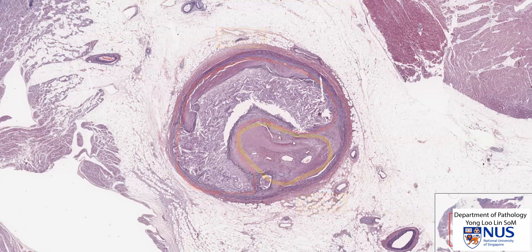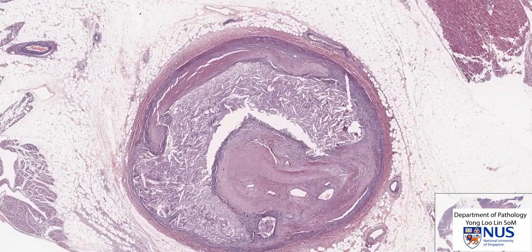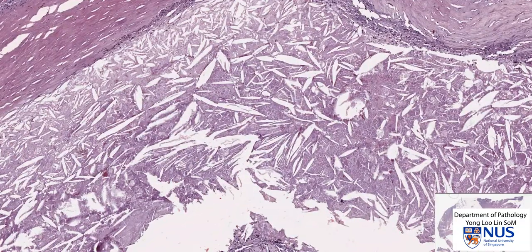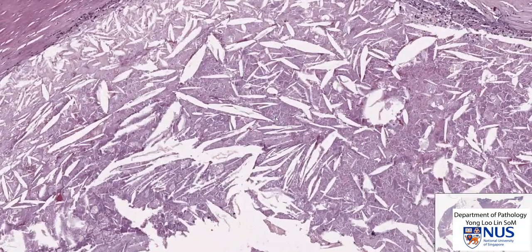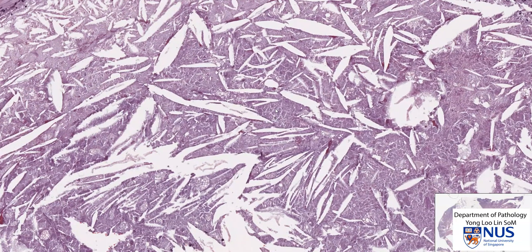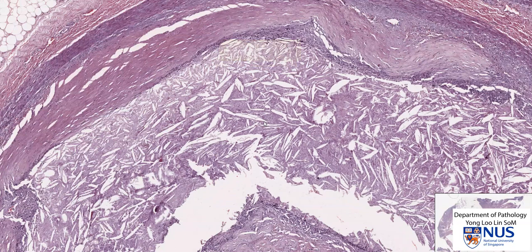Let's look at the components one by one. I'm first going to demonstrate the microscopic features of the atheroma. Here is the lipid core of the atheroma, and on high magnification we don't see a lot of cellular material, but we see this pink amorphous material and a lot of these empty cleft-like spaces. These are known as cholesterol clefts, because the lipid washes out during the processing stages of the microscopic slide, and hence they end up looking like empty spaces.